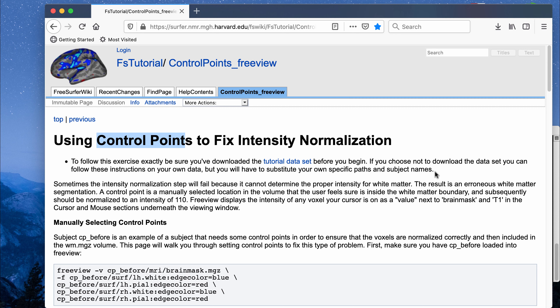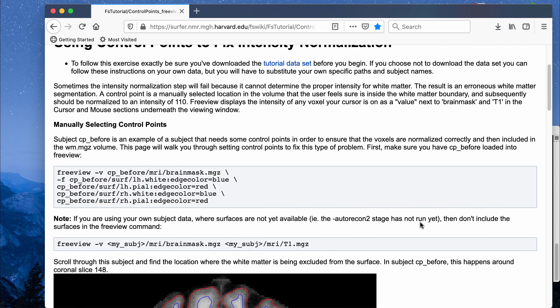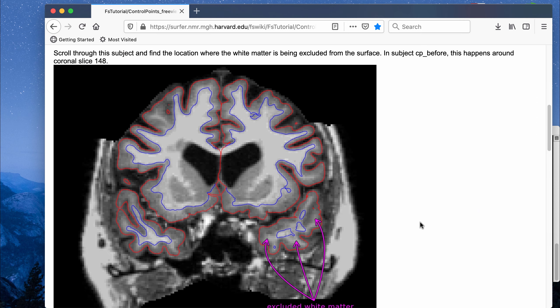In this video I wanted to do another FreeSurfer video. I wanted to do this tutorial on control point editing, which is one of the manual steps in the process of analyzing FreeSurfer output.